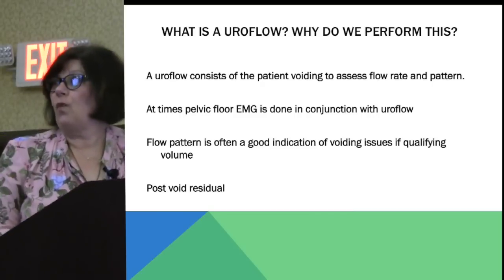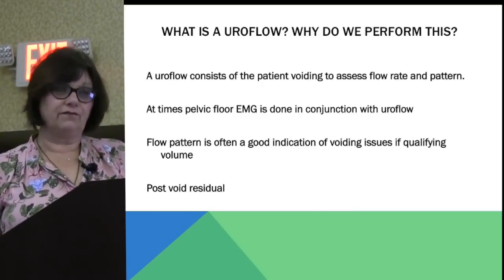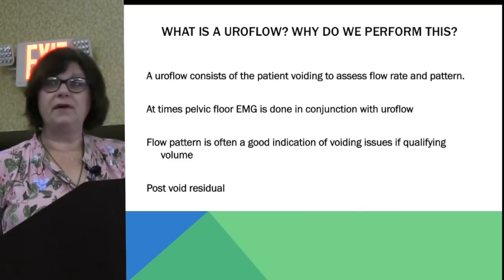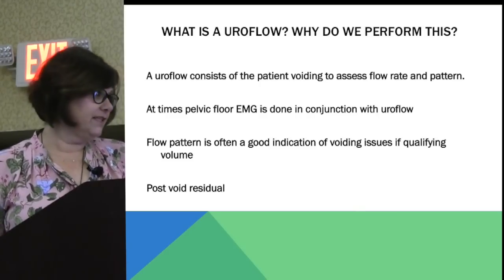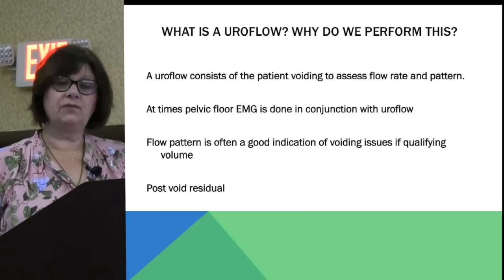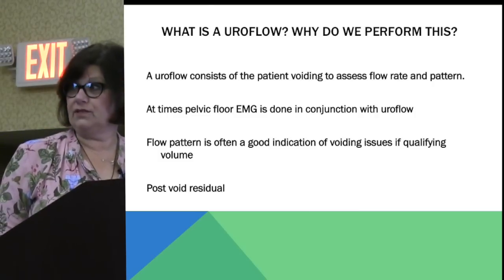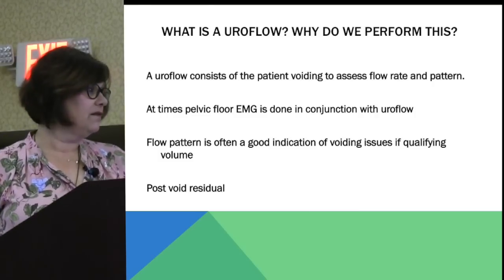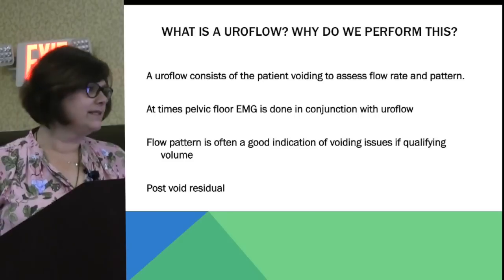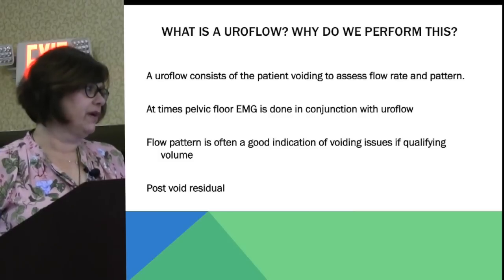So what is a uroflow and why do we do it? A uroflow consists of the patient voiding so we can assess their flow rate and flow pattern. It is the clue and answer to many issues in urology, BPH, pelvic floor dyssynergia, just to name a few. At times the pelvic EMG can also be done with just a straight uroflow. It also gives more information about the pelvic floor muscles, the tone of the muscles themselves, whether they are weak or too tight. So it's a good idea, if you're able to, to do an EMG along with just a straight uroflow.